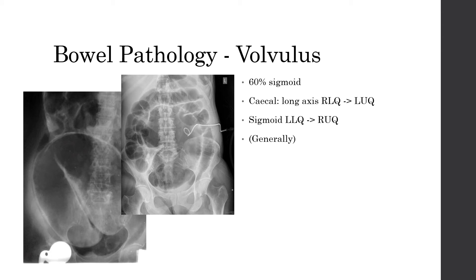A specific case of obstruction is volvulus, where the bowel has twisted around its mesentery and can become obstructed. If it twists too far, the blood supply can be cut off and the bowel can become infarcted. They talk about the coffee bean and kidney bean signs, but a potentially better way is to look at the axis of the fold. For sigmoid volvulus, we generally see a left lower quadrant to right upper quadrant axis, as seen in the left image with the false hip. For caecal volvulus, you tend to see right lower quadrant to left upper quadrant, as in the image with the drain in situ.